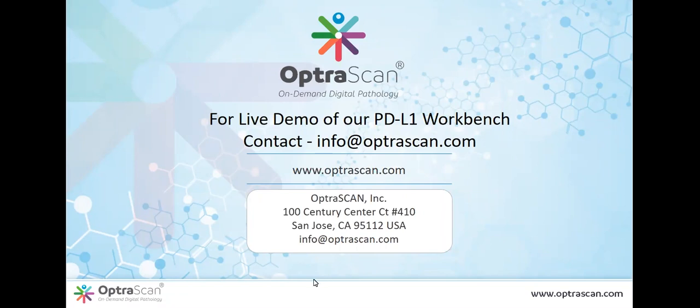My advice would be that those that are interested should pursue it and try it with the basic caveat that they will need to do some internal quality control and validation in-house to ensure that the algorithm is performing the way that they would hope and expect in their own institution. But that's what we have to do when we set up any immunohistochemical stain anyway.